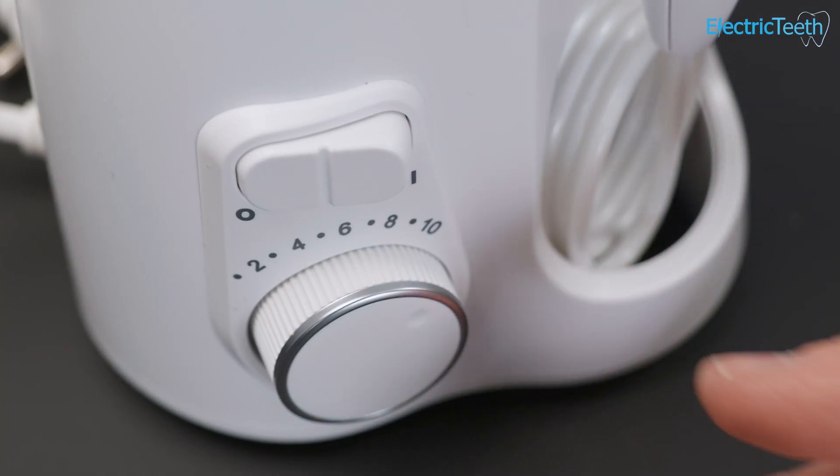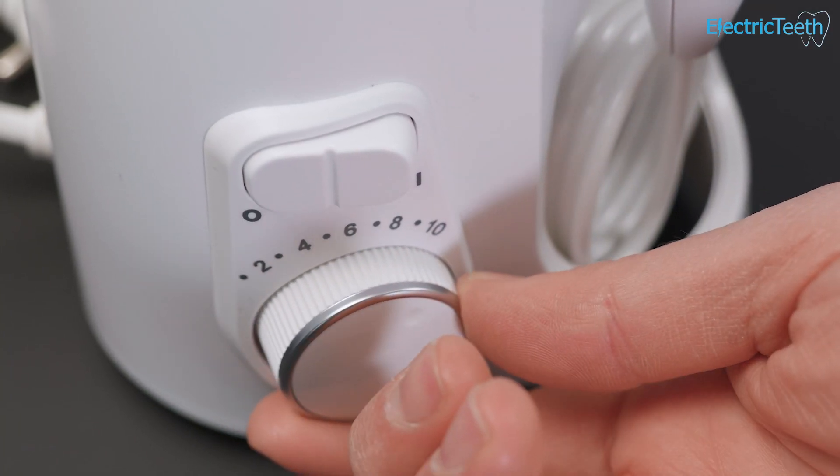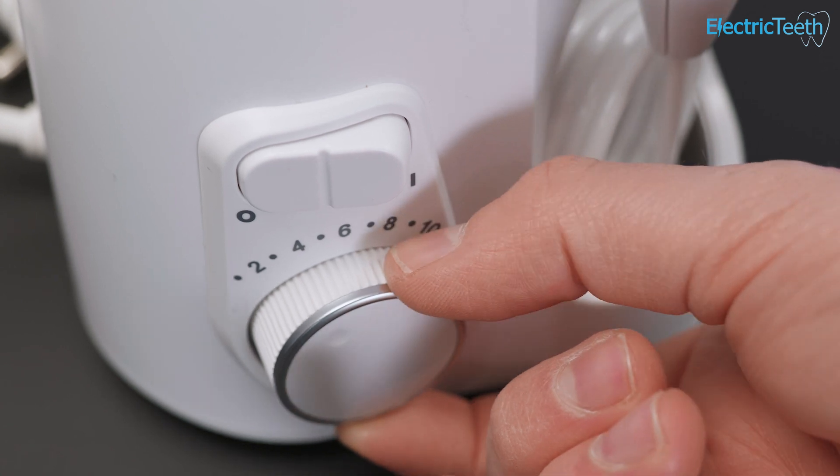Obviously that does affect the running time from the water tank, but it's really nice that you have that flexibility in terms of the pressure. Some days you may want a more intense cleaning, other days something a little more gentle. All you have to do is rotate the dial to a setting you find most comfortable.